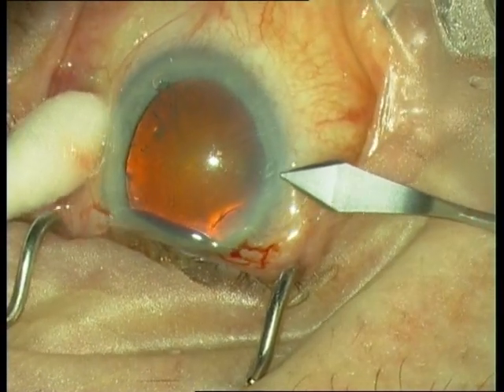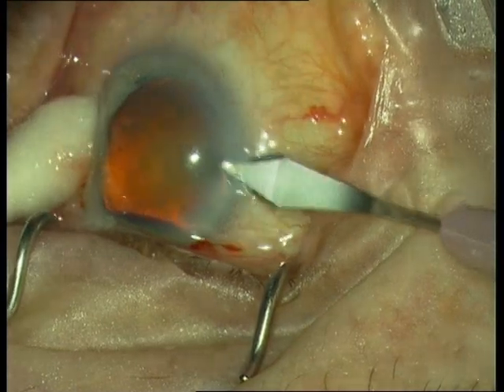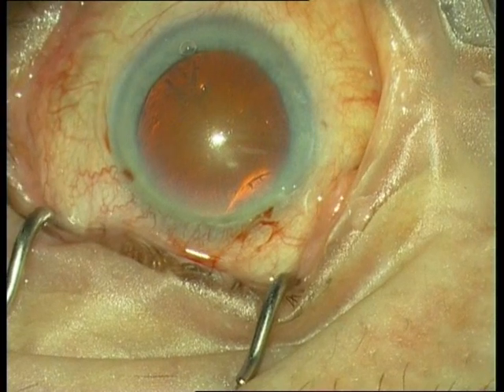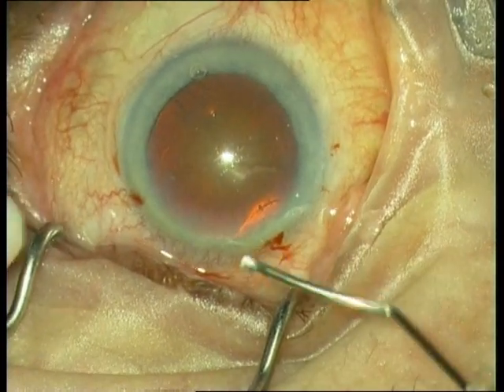Look for the details in the book. The tunnel scission is a quite difficult maneuver. It is a lamellar cut.